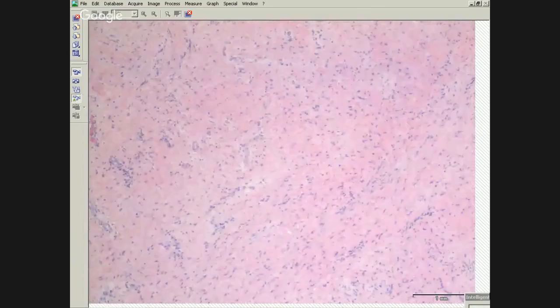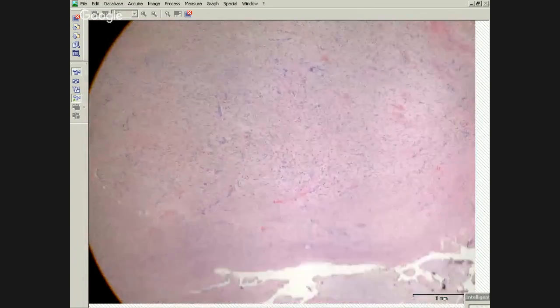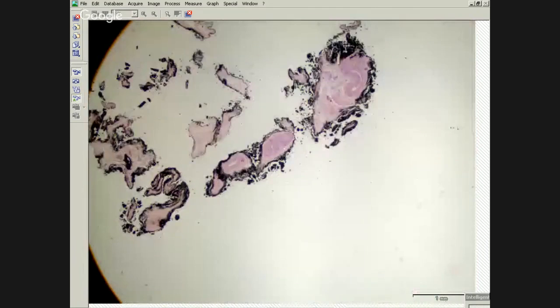There's some inflammatory sprinkling, like there are some inflammatory cells here and there. Some lymphocytes. Good. You guys are stars. All right. Yes, a desmoid tumor of the pleura. Keratin negative.